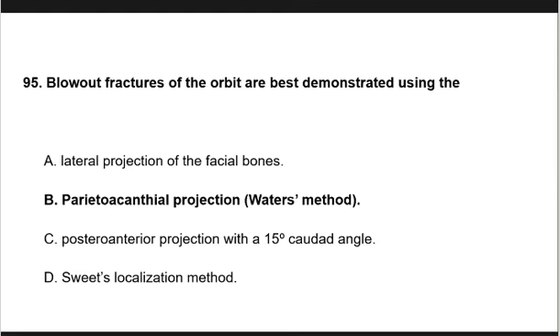At ano ang nagde-demonstrate ng blowout fracture? That is modified Waters method. So ilang degrees? Pag modified Waters, ilang degrees ang OML? 55 degrees ang OML in relation to the tabletop. No, 55. Wait lang ha, titingnan ko lang. Yan, 55. Yan, modified Waters. Yan, tama yon.